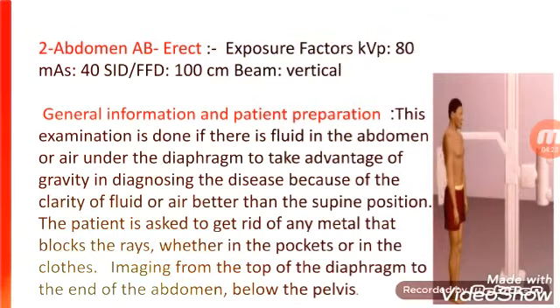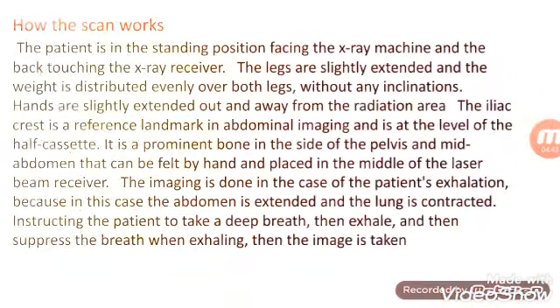The patient is asked to get rid of any metal that may block the beam, whether in the pockets or in the clothes. Imaging is from the top of the diaphragm to the end of the abdomen below the pelvis.